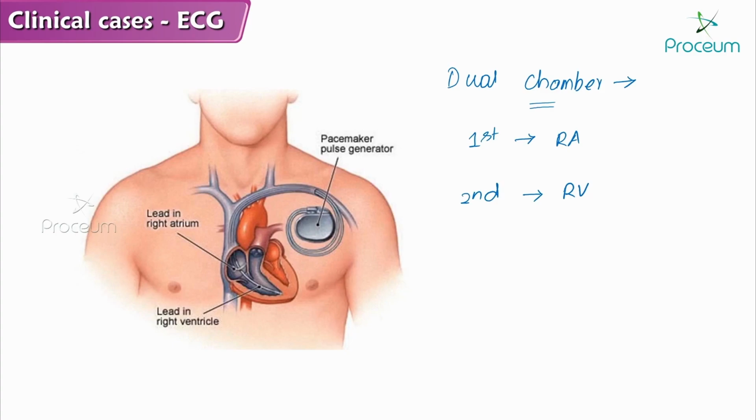Now, the lead you have placed in the right ventricle, what will it do? It will activate the right ventricle first.